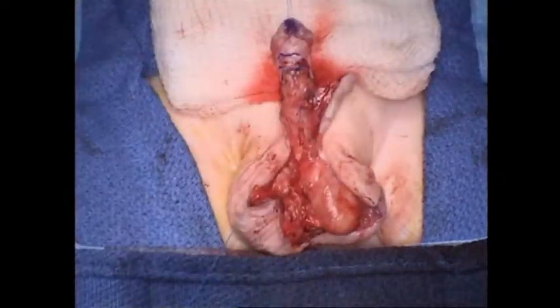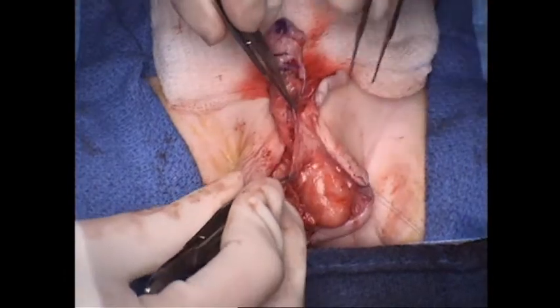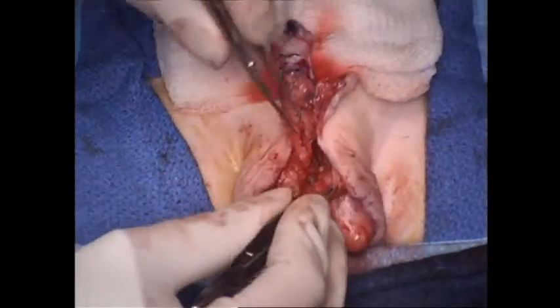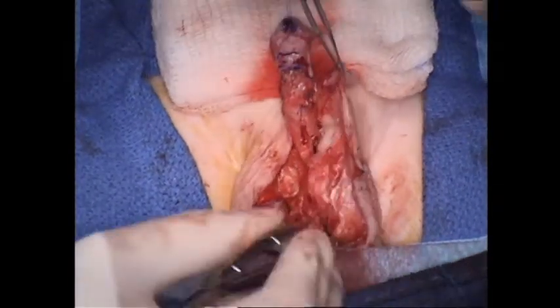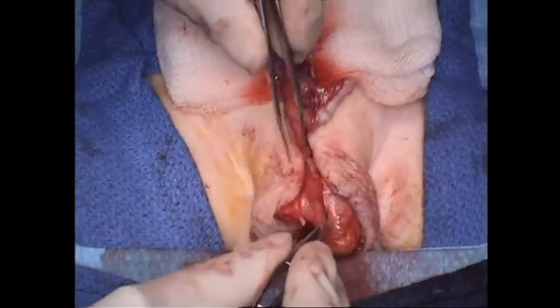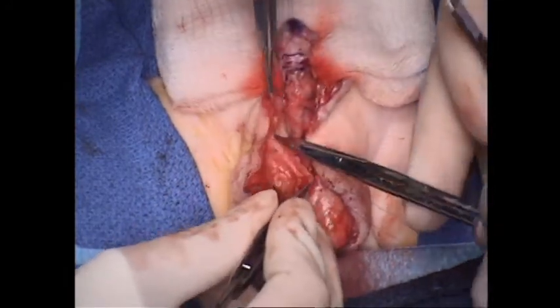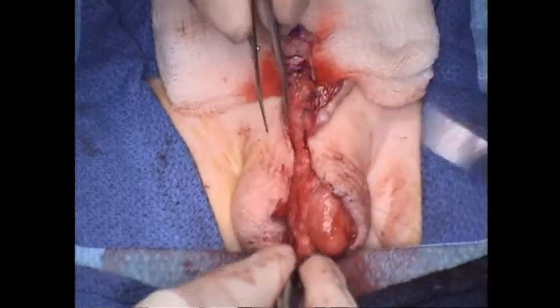And sometimes we actually have to move the testicles down superficially, like right here, so that we can create a nice penoscrotal junction without those testicles in our way. This is another reason not to do orchiopexy first. That's right. The scrotum in boys with proximal hypospadias is not in the correct anatomic position. We saw earlier in this case how it went up onto the base of his penis.